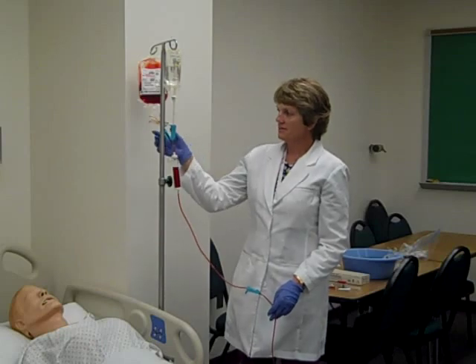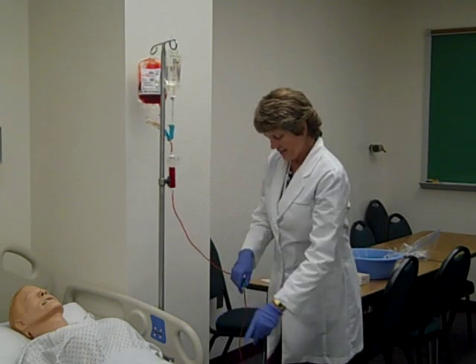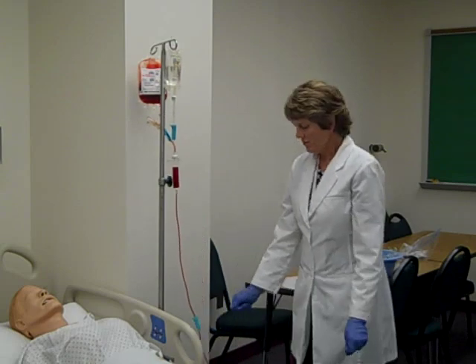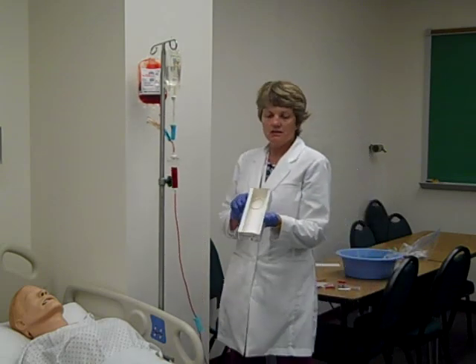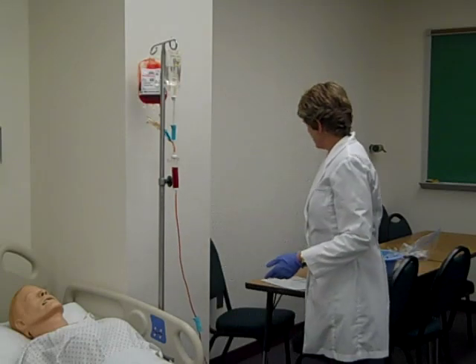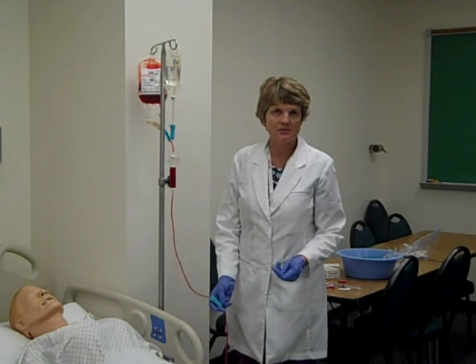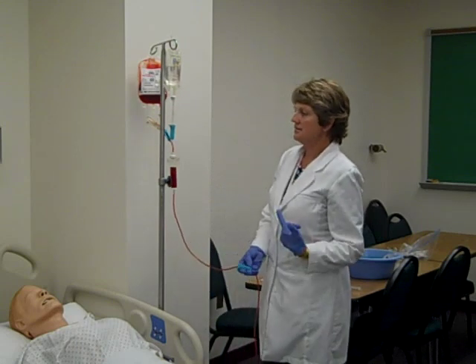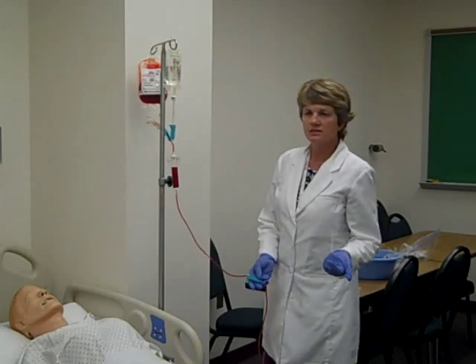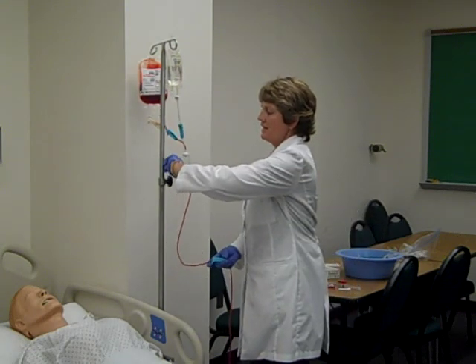So because of that reason also, I'm going to run this blood at a slower rate for the first 15 minutes. So it's down to the saline lock, and I'm going to run this blood at 75 milliliters an hour. So again, if I figure out my drops per minute, 75, my tubing is 10 drops per ml, and if I take my magic number and put 6 into 75, I think it's about 13 drops a minute. So I'm going to take that 13 and divide it by 4, and it should come out between 3 and 4 drops every 15 seconds. So I'm going to go ahead and regulate that.